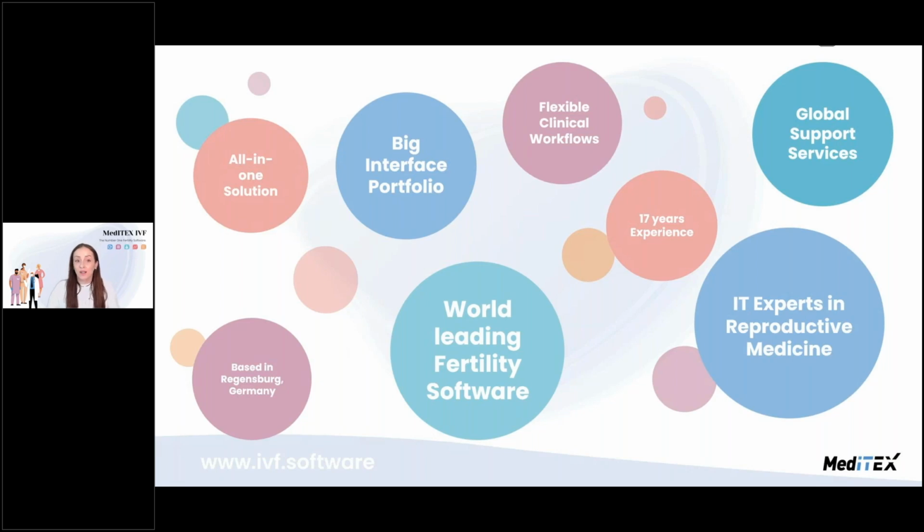MedITEX is also an all-in-one solution, so it's not only the MedITEX IVF software, we also provide modules such as scheduling tools, accounting tools, and more. We also have an embryologist in our team to really understand what our clients need, to get these insights and to really see the necessary requirements of clients working in this field.